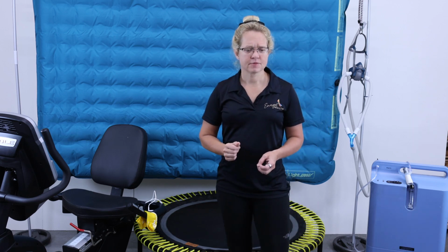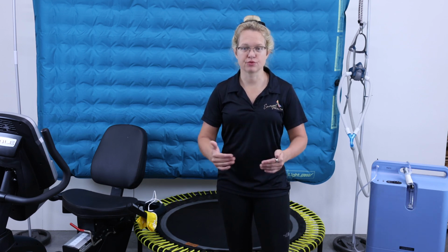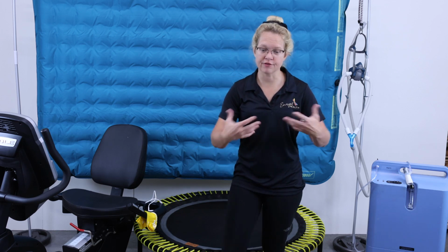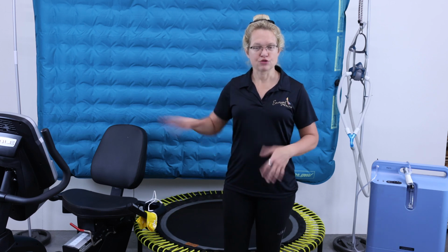Most oxygen reservoir bags that are used for EWOT are made out of this particular plastic, because it doesn't off-gas chemicals that cause or impart a smell to the oxygen. And that's why I bought this one.